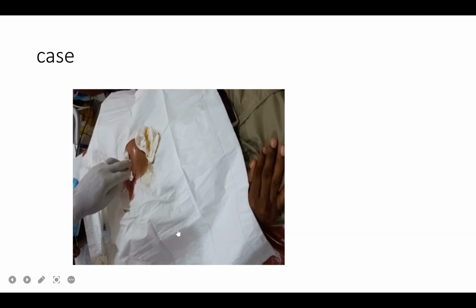The most important thing is that you must adequately prepare that skin. If you don't adequately prepare the skin, the patient will get infected. So the number 1, number 2, number 3 precaution is skin preparation. If you get that skin preparation right, you have a good day to go with. Then, as Dr. Chris said, you push it under the subcute. Once you get adequate anesthesia along the path where you will push the trocar, the patient just relaxes.